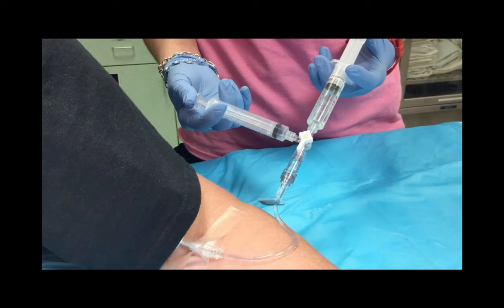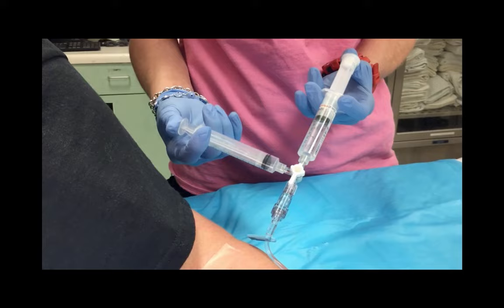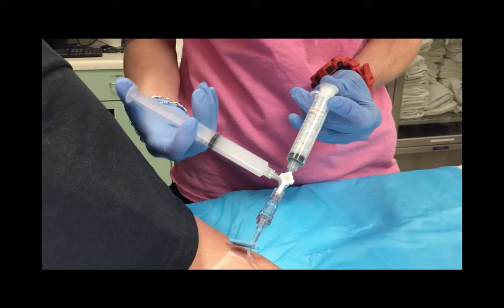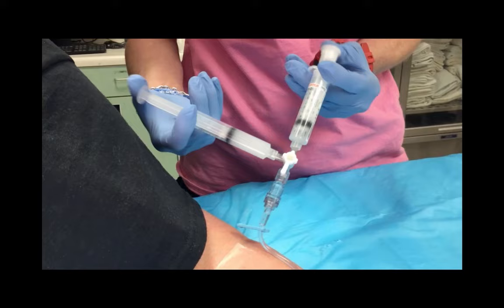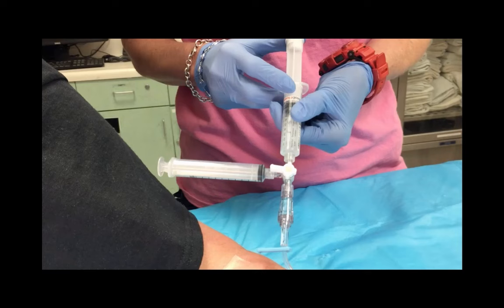Wait for the registered cardiac sonographer to say, begin agitating the saline. Then the RN will agitate the saline solution by closing the valve to the patient's IV and rapidly injecting the solution between the two syringes several times. The fluid is adequately agitated when the solution appears cloudy. The sonographer will say, go ahead and inject. Before injecting, ensure all of the saline is contained in one syringe and communicate that the saline is being injected. Open the valve to the patient's IV and inject the saline solution. This process may need to be repeated at least one more time.